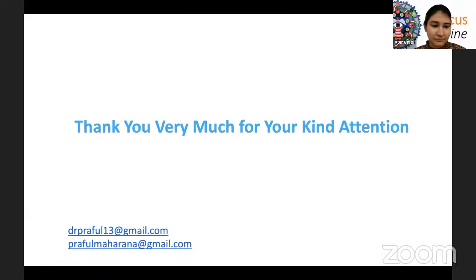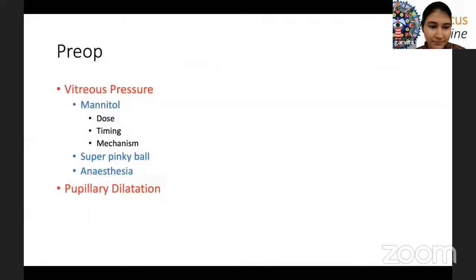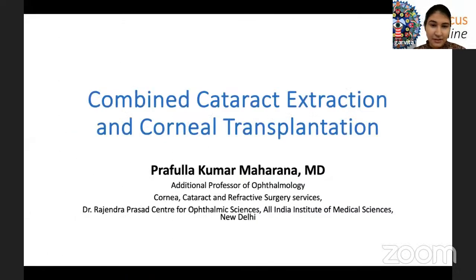Garvita, my PPT is visible, right? Yes, sir. Good evening, everyone, and to all my students. So today's topic is combined cataract extraction and cornea transplantation. I think this is the cataract module going on, so my focus will be primarily on cataract surgery and the other complications that can occur when you are doing cornea transplantation with cataract surgery.